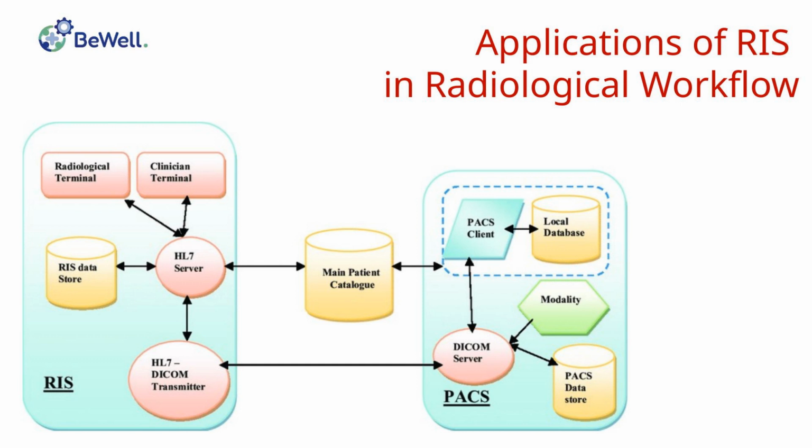legal disputes. Regarding archiving, the IS handles the storage of textual information collected and generated during the diagnostic process. The Picture Archiving and Communication System, PACS, is the information system used for image archiving. Generally, the IS keeps all reports online for at least 1 year.